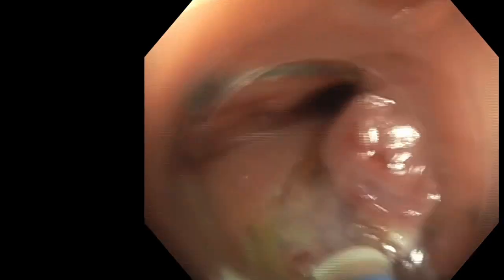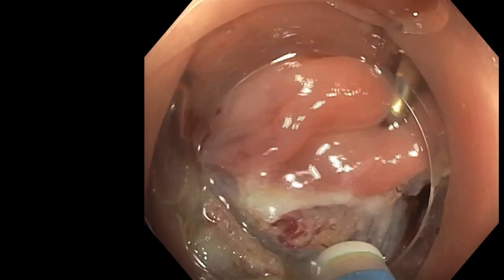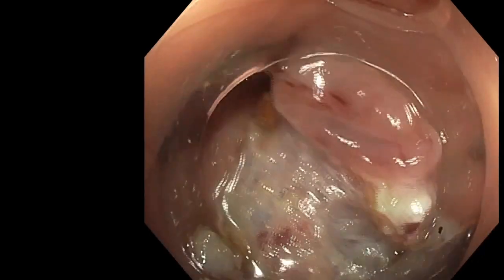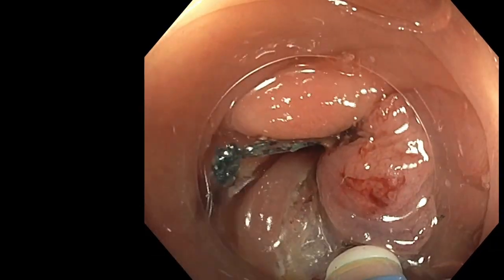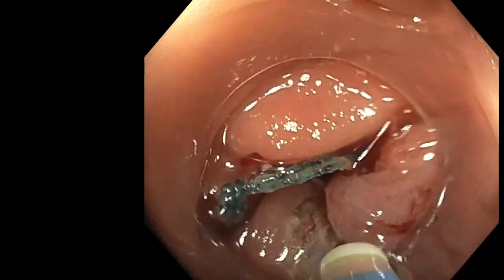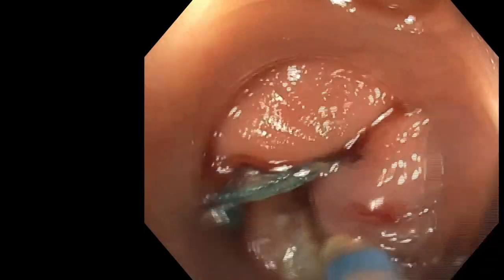Here you should go slow at the beginning of this part because sometimes the muscle is also attracted by the traction, like here. So the initial incision and ESD is relatively difficult, but it was really difficult before traction to find this area.